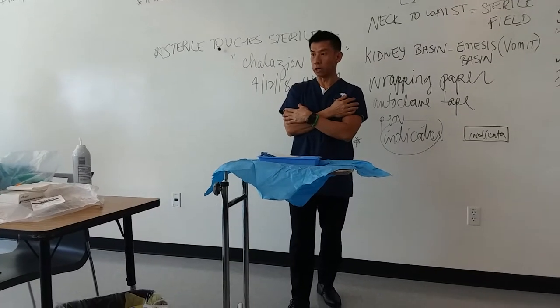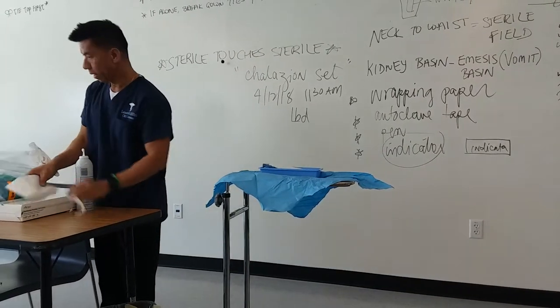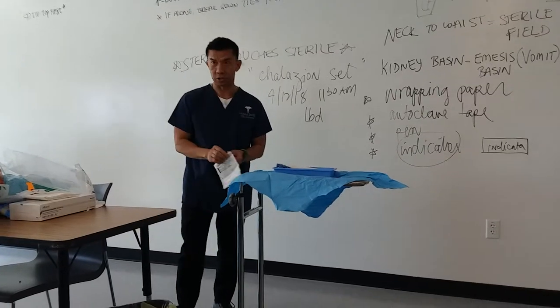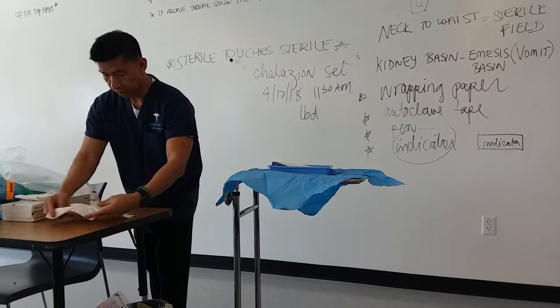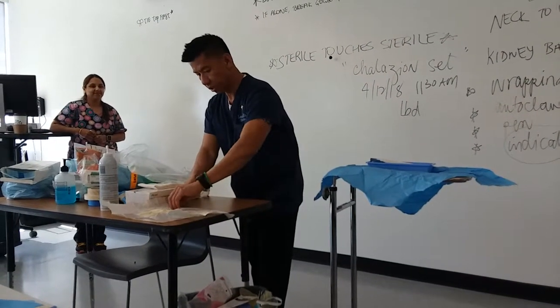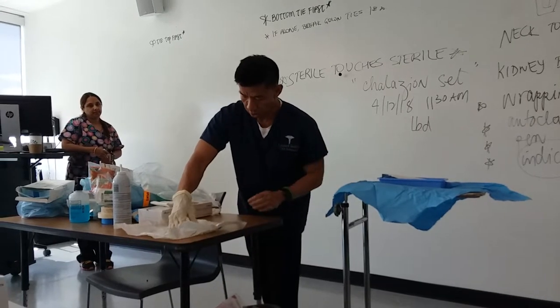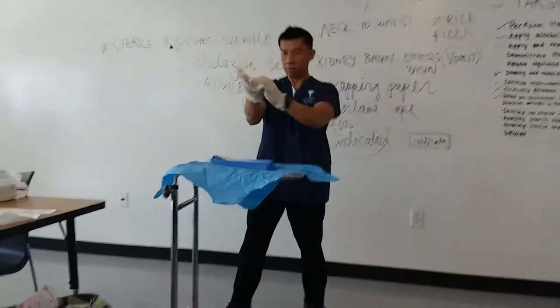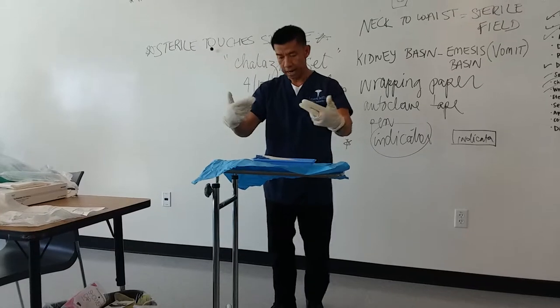Can I touch this with my bare hands? No. So what should I do? Put on sterile gloves. I'm gonna put my sterile gloves on. I have a closer for me — perfect, thank you. Okay, so I can arrange that supply but I cannot touch it with my bare hands. The doctor is in a hurry — this is an emergency procedure so I have to do it fast.